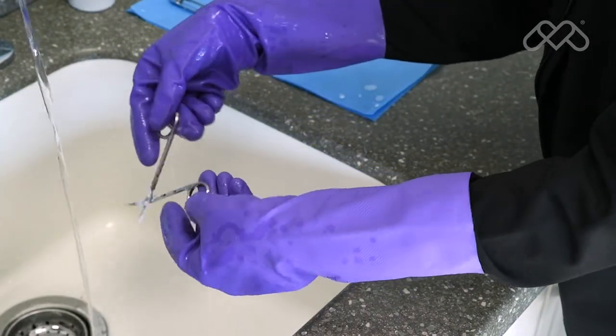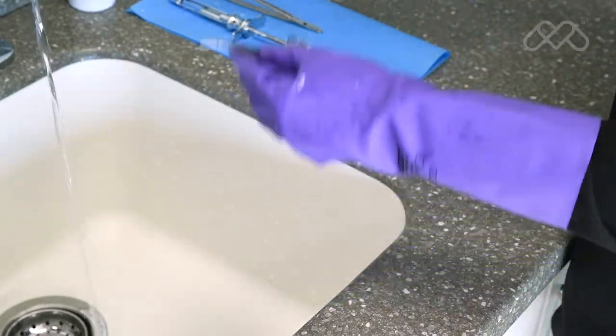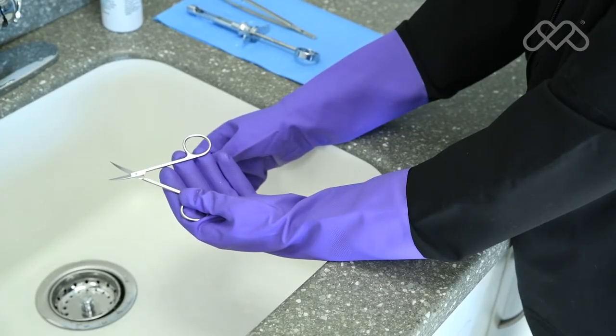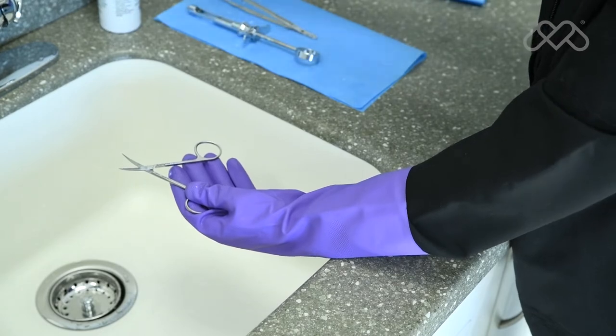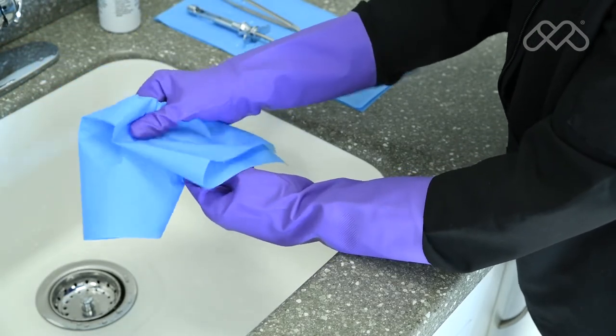After rinsing, instruments should be inspected for damage, debris, and detergent residue, then dried completely before packaging. If the instrument manufacturer's instructions require lubrication of the instruments after cleaning, wipe off excess lubricant before packaging the instrument for sterilization.